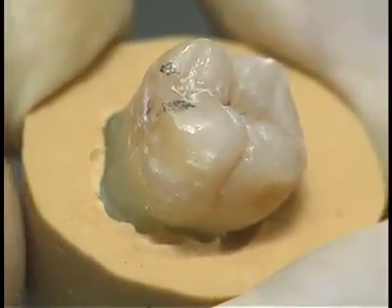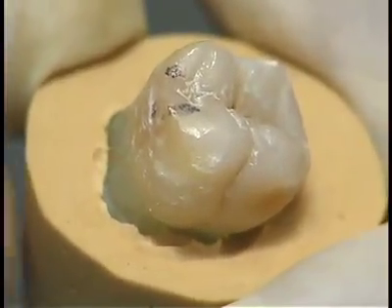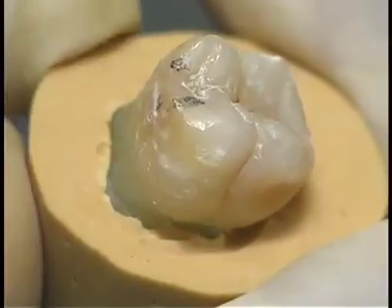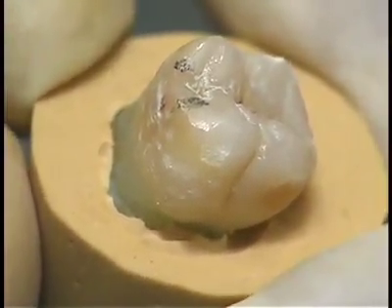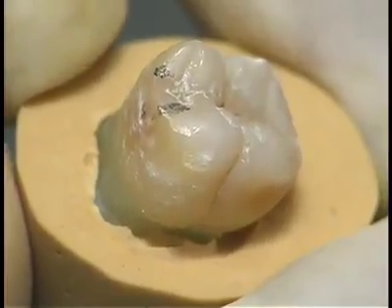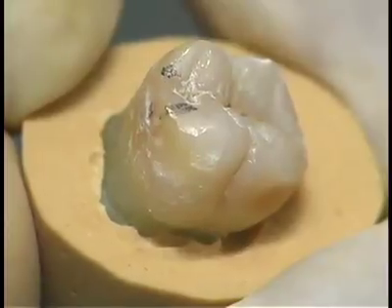By doing an ideal cavity preparation, the extent of the carious lesion on the pulpal, lateral, and axial walls is seen. If there is any remaining carious lesion, it is removed. Any remaining carious lesion is removed only after establishment of the ideal internal and external outline forms.